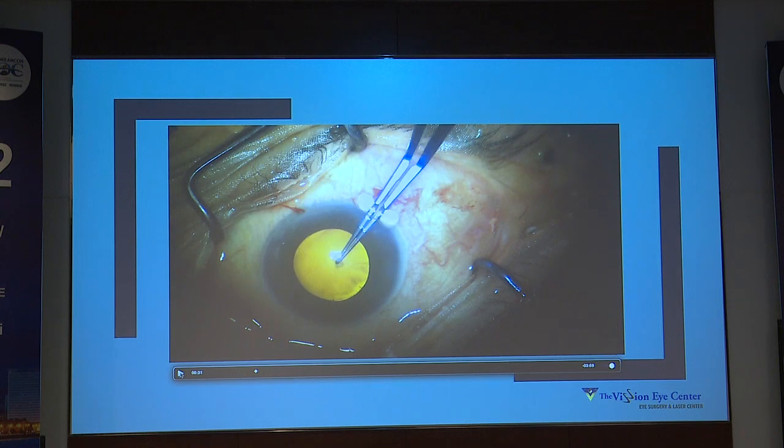I could pull the Descemet's with me. I could take the iris with me. The iris can walk out. Every time the viscoelastic walks out, I can get into trouble right here and now. Why am I showing you this? I just want to show the goof-ups I made, how one should not be going in further with that. By the time I try to do my rexis, if my iris has started going down, I would have trouble.